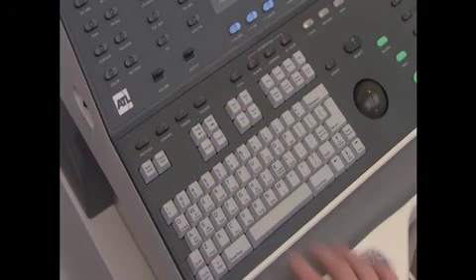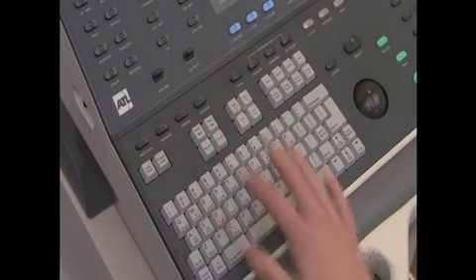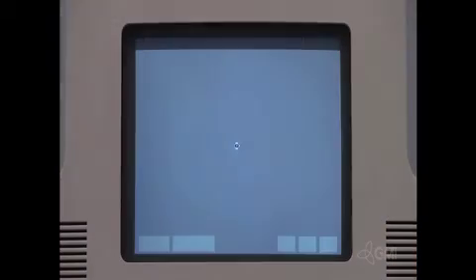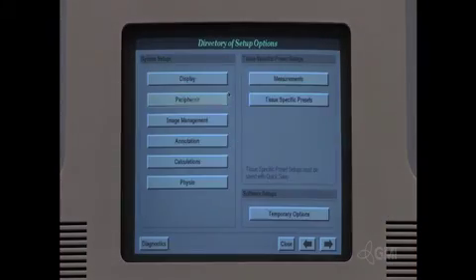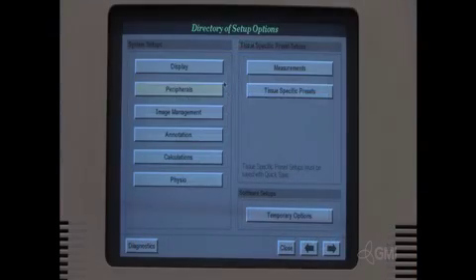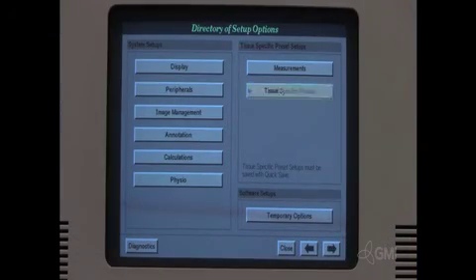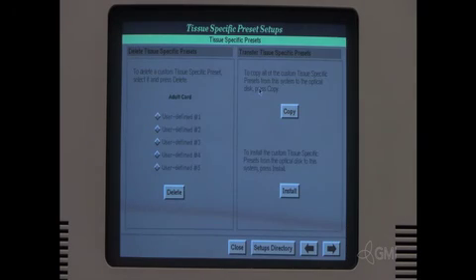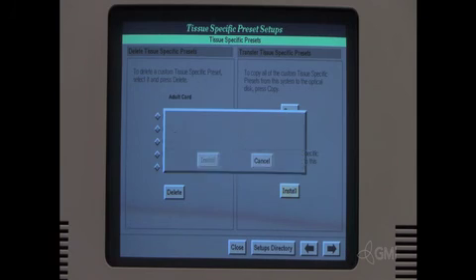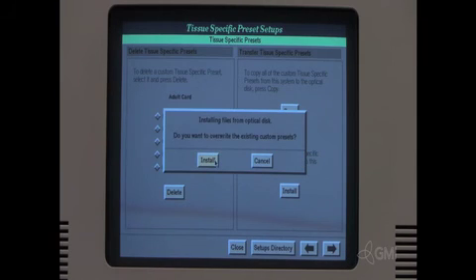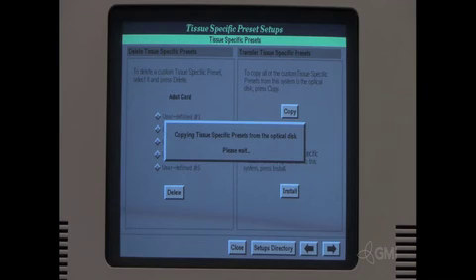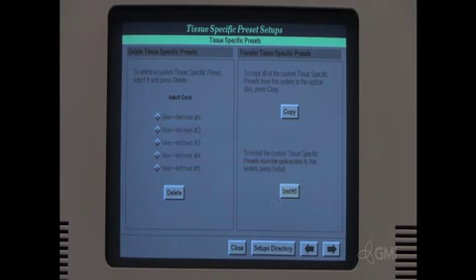Press setups. Select tissue specific presets. Insert the backup optical disk. Select install. Select install. Select install. Select close.